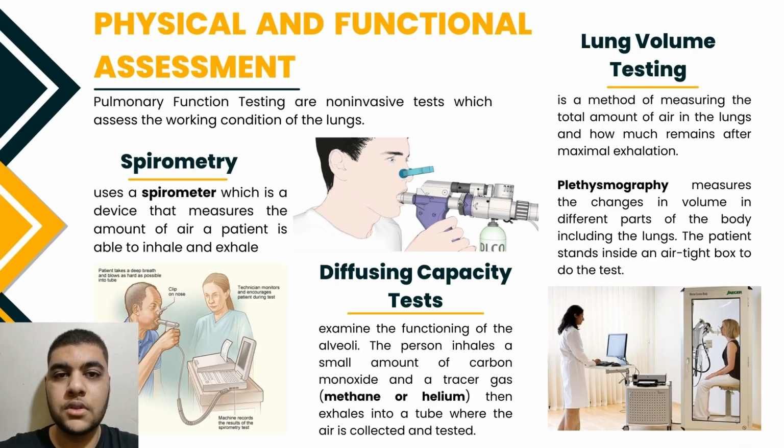Pulmonary function testing is non-invasive testing which assesses the working condition of the lungs. There are many types of this test. Today we'll be talking about three types. First, spirometry, which uses a spirometer, a device that measures the amount of air a patient is able to inhale and exhale.